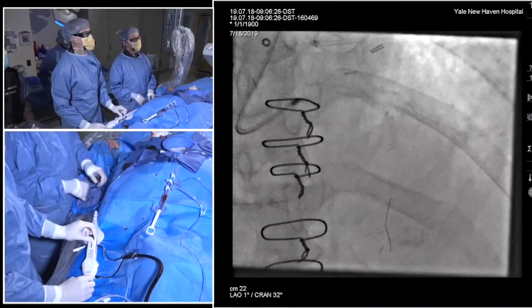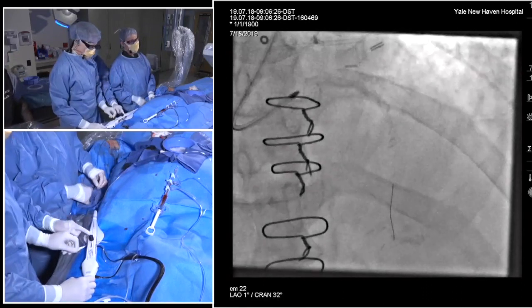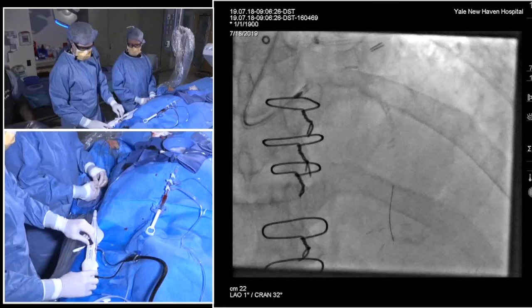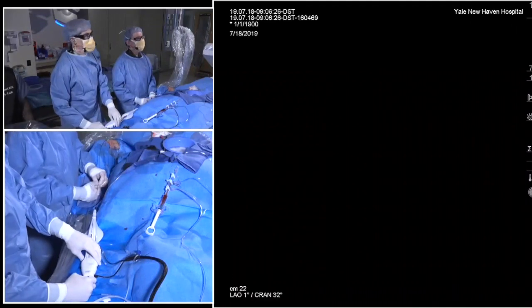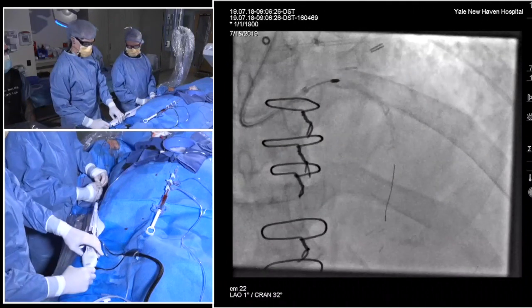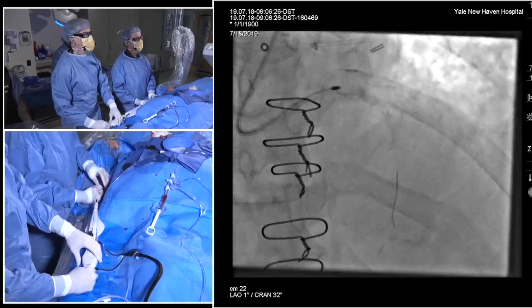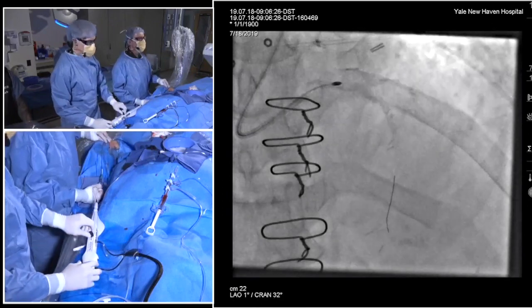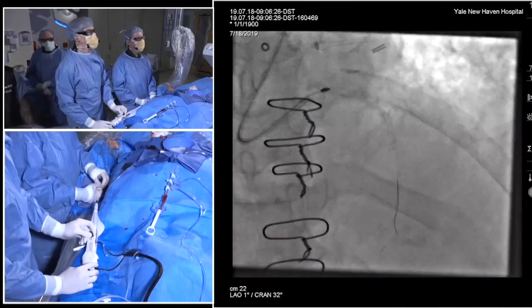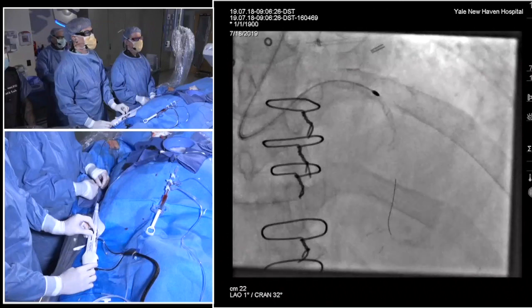Yeah. So there are a couple of points worth mentioning with this case in particular, given her petite size, given her sex, given the fact that she's on chronic steroids. Not only is she at higher risk for vascular complications, which, by the way, would also lean you against using a support device in a large bore sheath, but during atherectomy in particular, there's a greater risk of perforation. And ways you can mitigate that: number one, you can take a floppier wire. At present, the CSI only has a stiffer wire, the Viper wire, which gives you more bias. So a floppier wire would tend to avoid that.